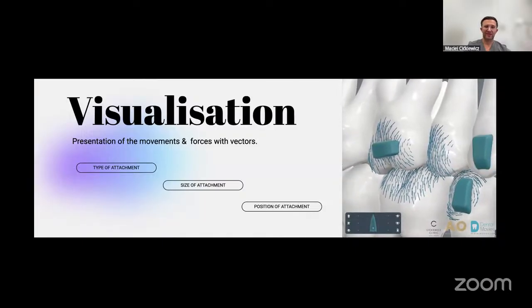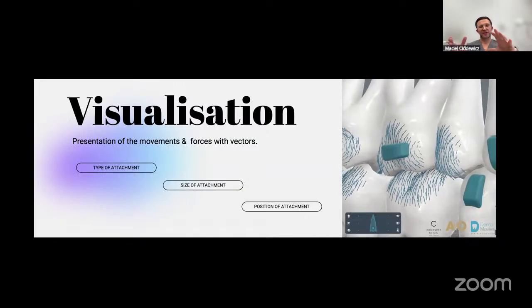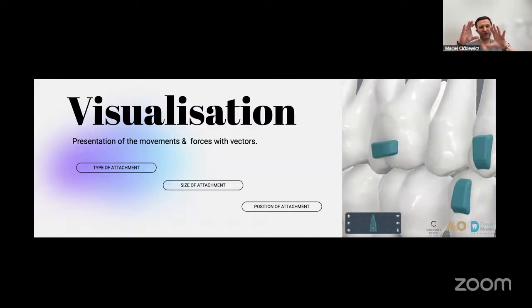So it means that they are behaving like the wind vectors from the weather. So, giving the options, if you rotate, or having options like for the torque, you're trying to figure out, you're seeing the forces exactly with the arrows, and then thinking about how you want to create the movements with the shape of the crown. Then you analyze that this shape of the crown is not giving good support, because you can't do this movement.